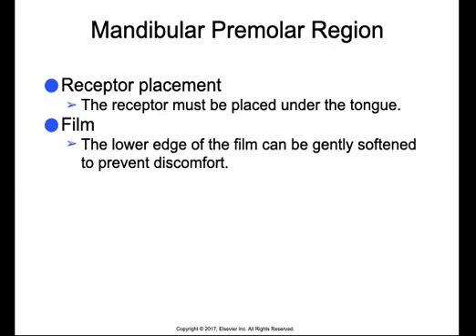The lower edge of the film can also be softened to prevent discomfort. Certain dental supply companies sell a special sticky foam that can wrap around the edges of the film so that it won't cut the patient's tissue.